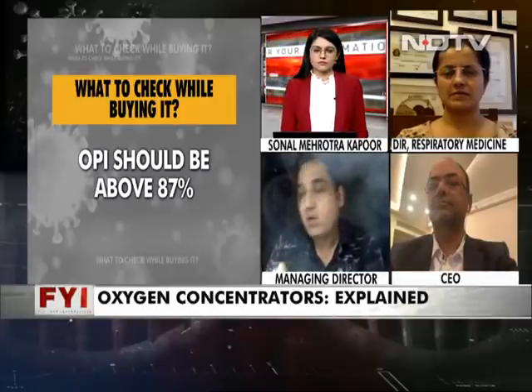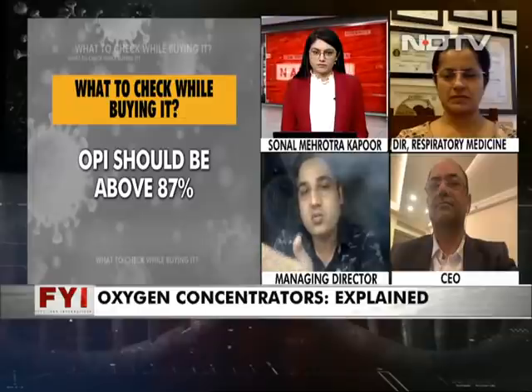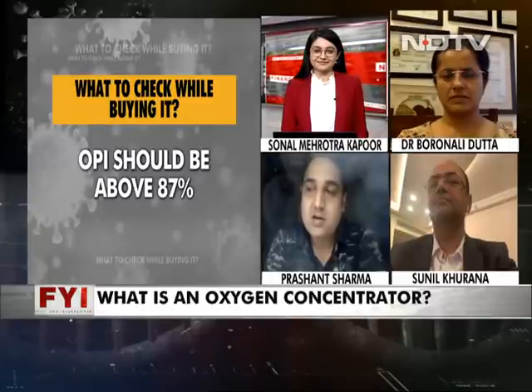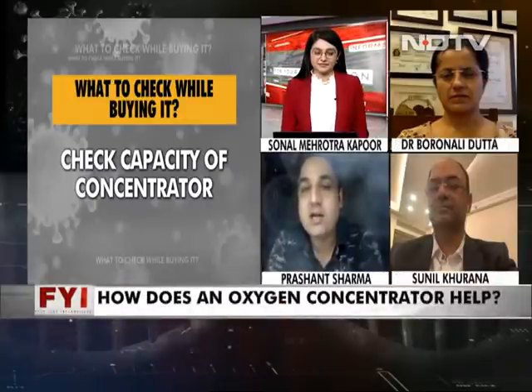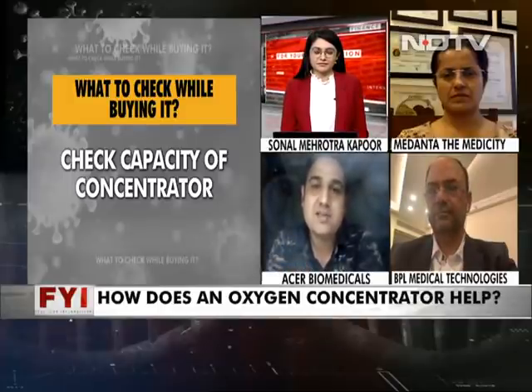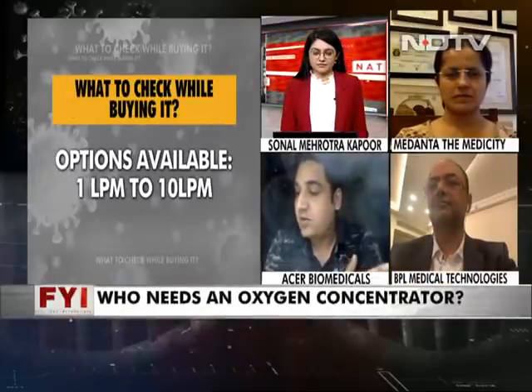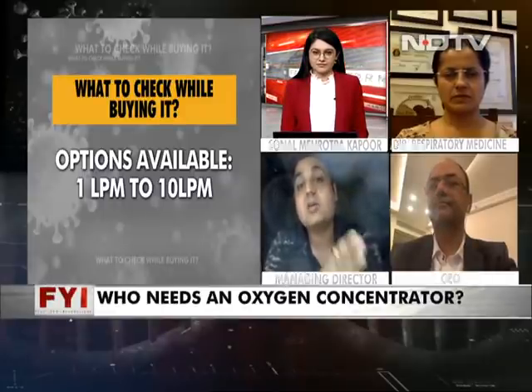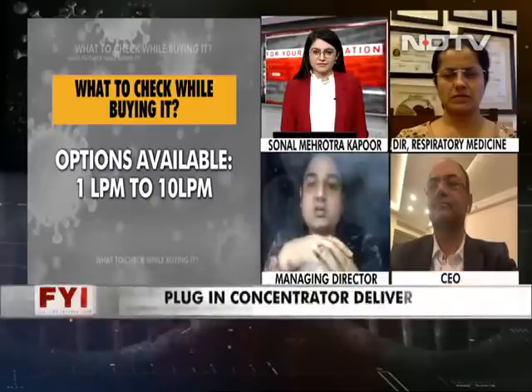So one more thing I would like to share on your platform, that a lot of questions came from the patients about whether we should buy a 5 liter oxygen concentrator or a 10 liter oxygen concentrator. As a seller, most of the questions that come to us are whether we should go for a 5 liter or a 10 liter. As Dr. Datta said, in 95% or more than 95% of the cases, a 5 liter per minute oxygen concentrator is more than sufficient. But when we talk about particular severe cases of COVID, sometimes we need 9 liter, 10 liter, or sometimes more than 10 liters also. In those certain conditions, you need to admit the patient into hospital.